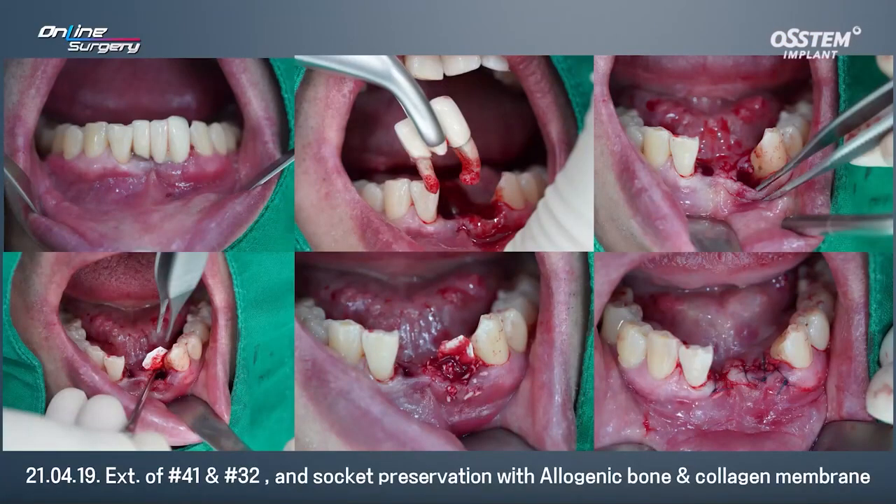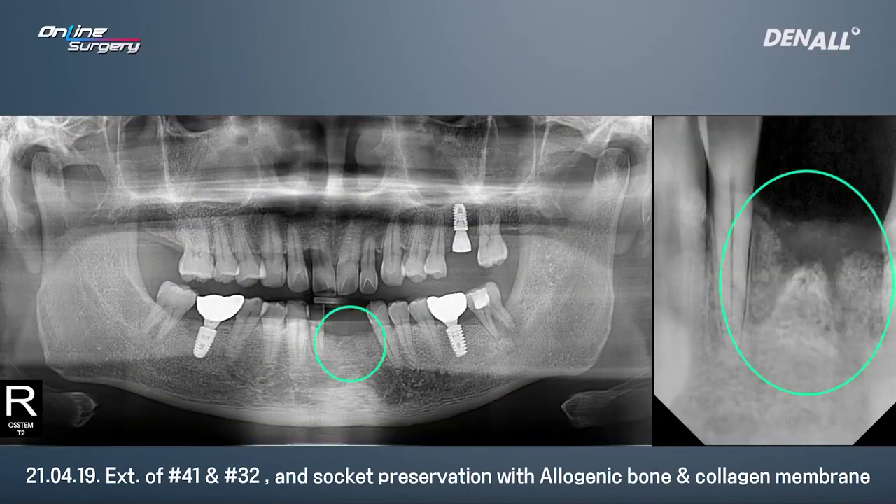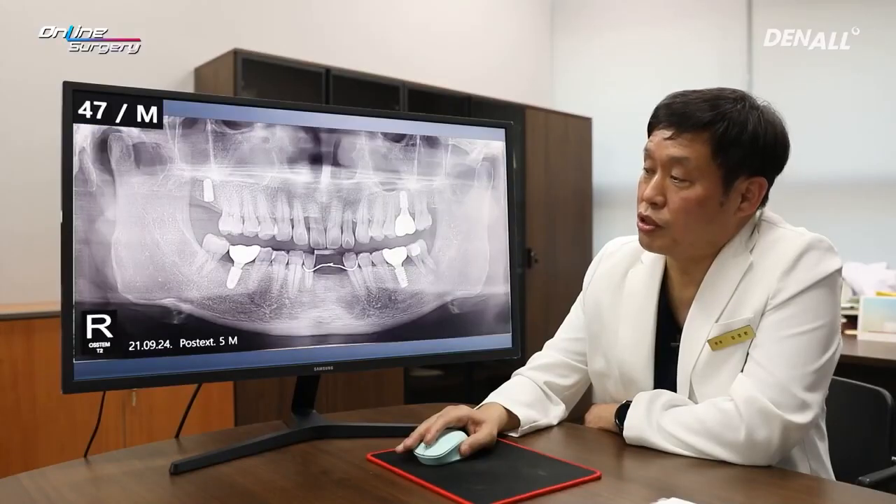In the lower anterior, I decided to remove the bridge, and this is after extraction. In number 22, you can see a periapical lesion. After extraction, you can see that there's a lot of alveolar bone destruction. I applied collagen membrane and used autogenous and allogenic bone graft to do socket preservation. This is after 5 months since surgery.